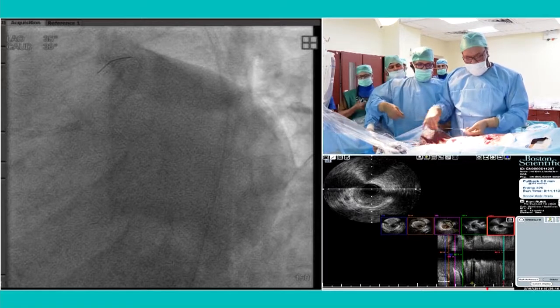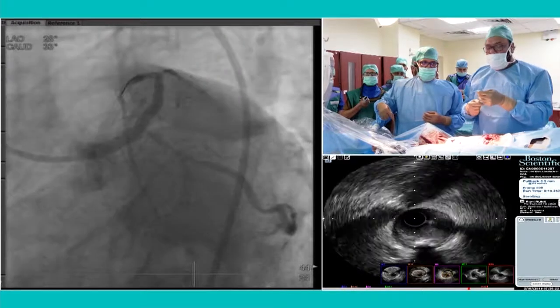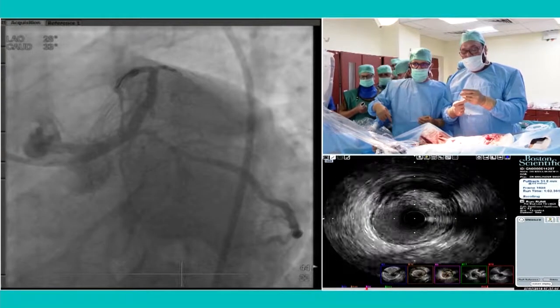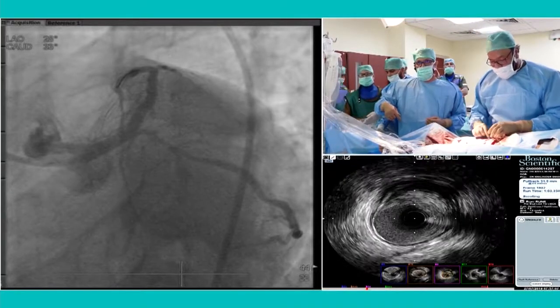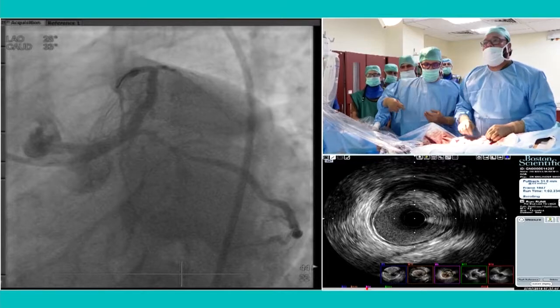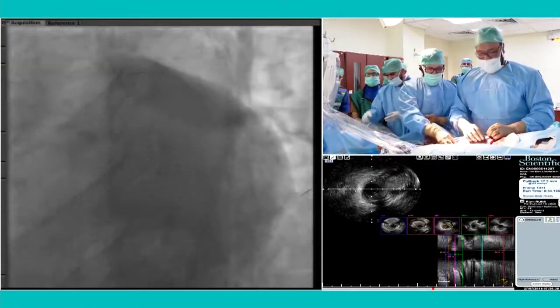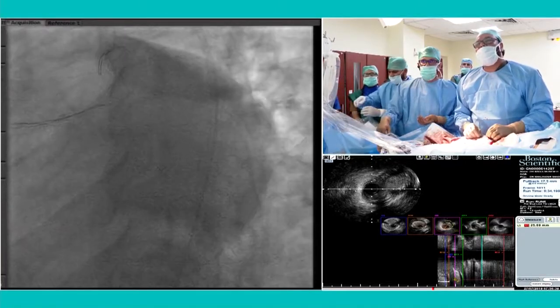It can be on a case-to-case basis. Recrossing of the vessel is actually much easier with the wire in place. If you have a very severe ostial disease, as the guideline says, it is very, very good. Yes, I agree. So it's just a personal thing. If somebody wants to keep the wires, it's always a safer bet.